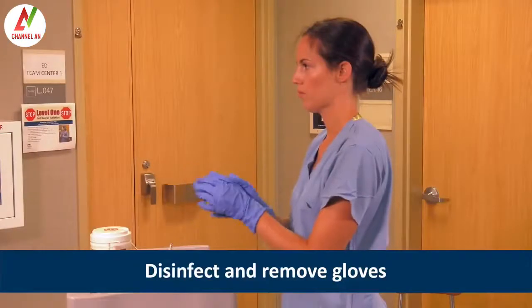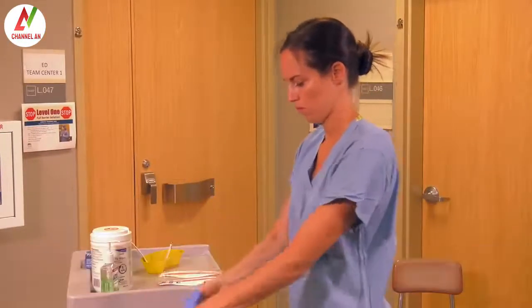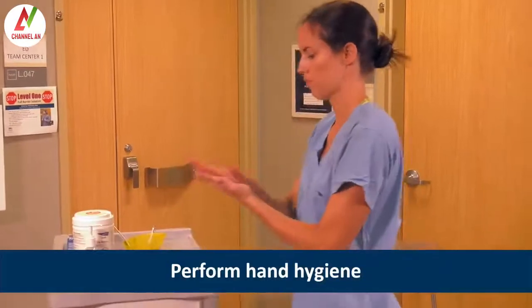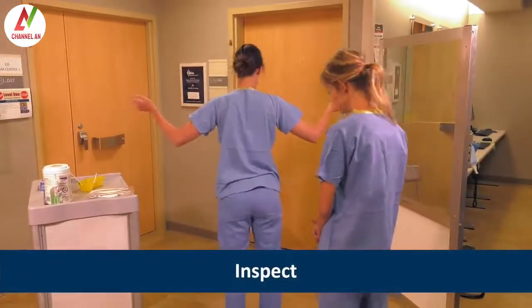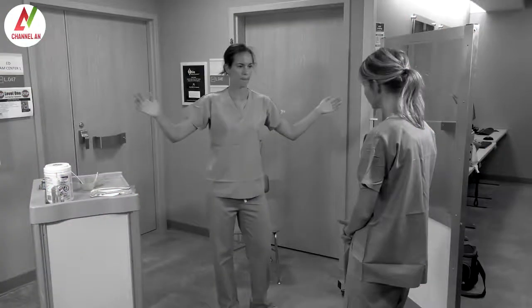Once the facial protection is removed, Heather disinfects and removes her gloves and performs hand hygiene one final time. Once all the Level 1 PPE is removed, Angie helps Heather inspect her clothing for contamination. If contamination is identified, Heather would need to shower immediately and inform the Occupational Health Coordinator about the potential exposure.